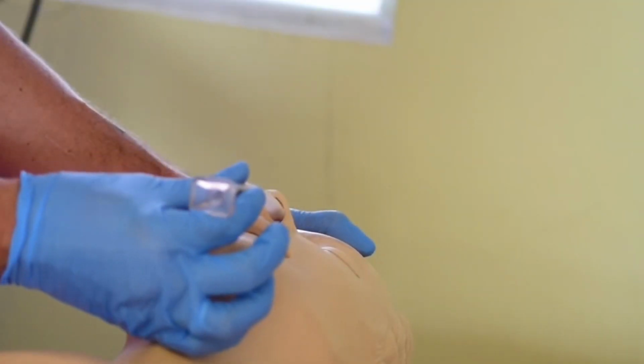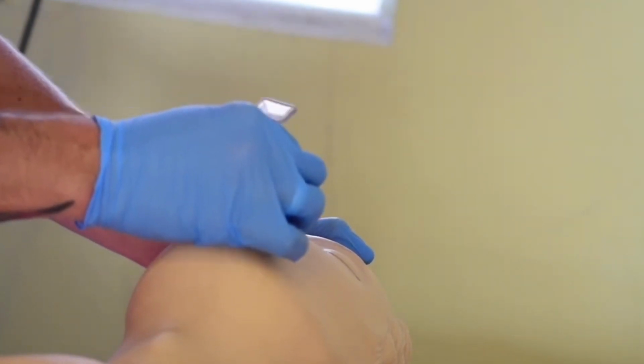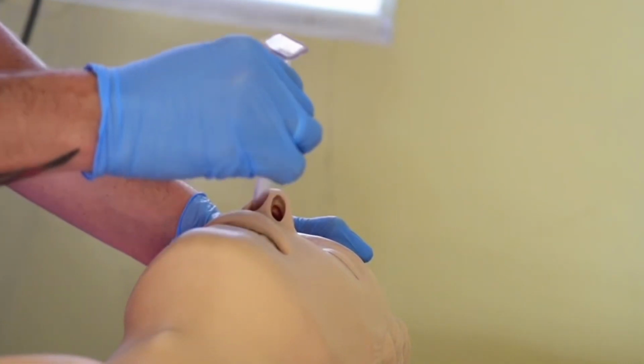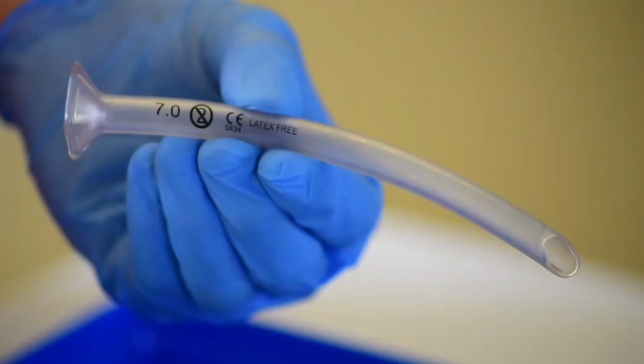Some resistance may be experienced on insertion. If gentle side-to-side rotation of the device cannot overcome this problem, insertion into the other nostril should be attempted. If resistance is still encountered, reassessment and alternative adjuncts may be considered. The device has a slight curve to it, reflecting the anatomy of the nasal airway. This alignment should be maintained at all times.